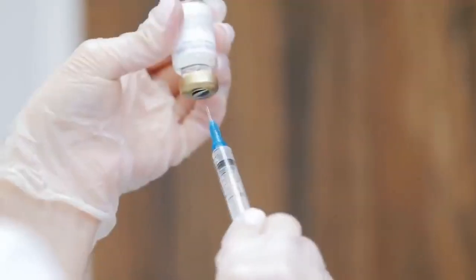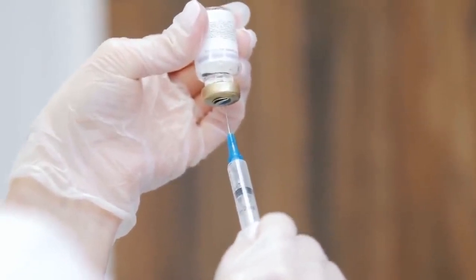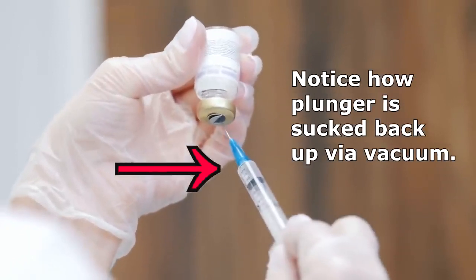While that is drying, we're going to take our syringe and instill air in the syringe, because we're going to take that air and actually inject it into this vial prior to removing the medication. Now, why do we want to do that? Well, we want to prevent a vacuum from forming inside this vial. For example, if not enough air is injected in this vial prior to removing the medication, it will cause it to be very difficult to remove the medication from the vial. And this is especially true for those multi-dose vials.